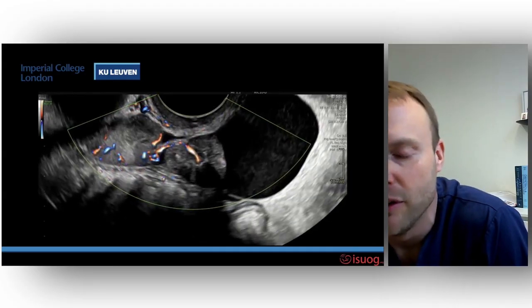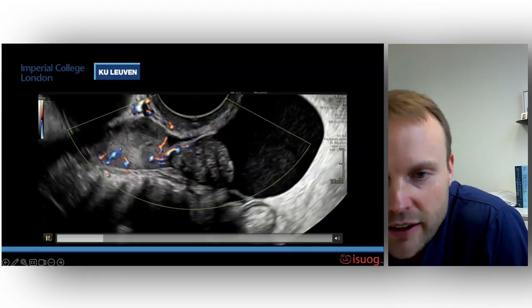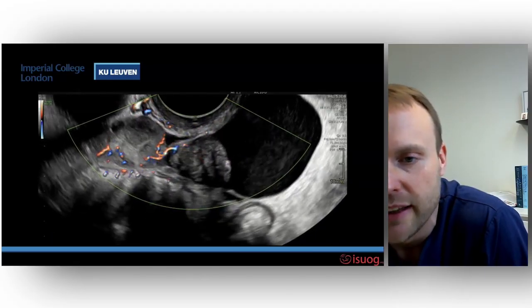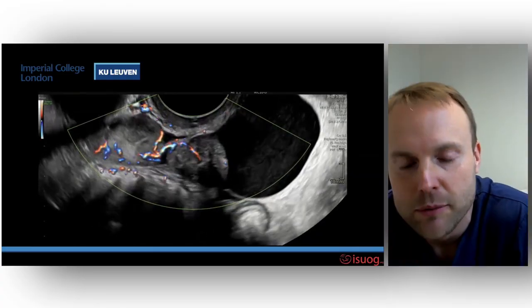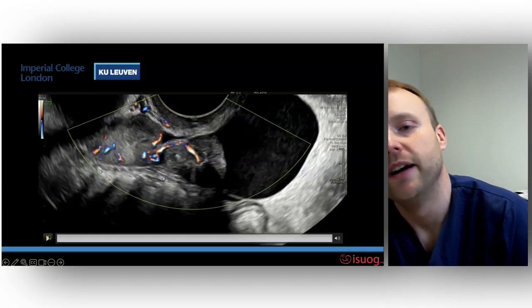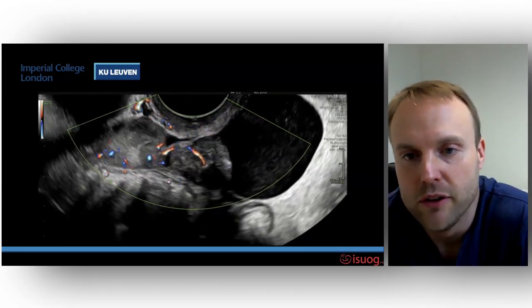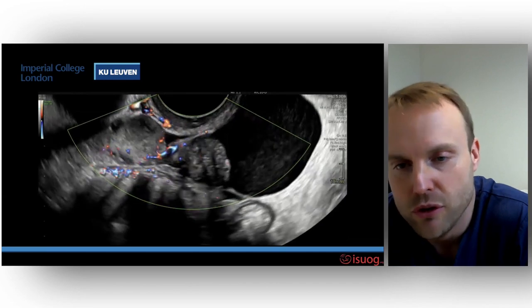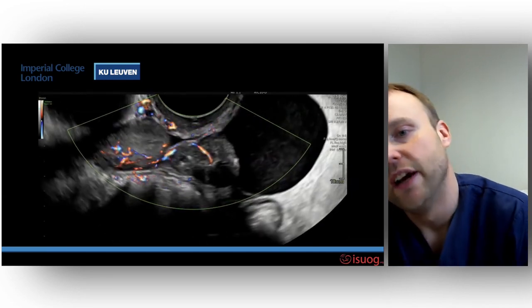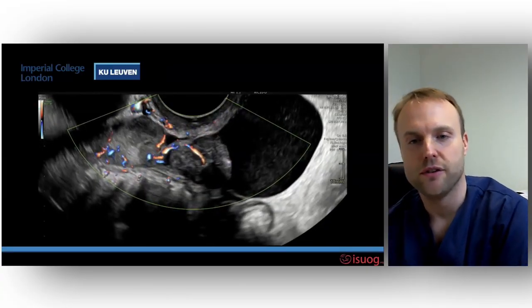You can see the normal ovarian stroma, and then you see this bridge of a vascular supply towards the lesion. So part of the ovary is normal, and then attached to that normal part of the ovary, we have the lesion. We cannot explain this by normal physiology. The color Doppler is not minimal. We don't need to search to find the vascularity. Looking together at the solid component and the wall of the cyst, we can assign color score 3.